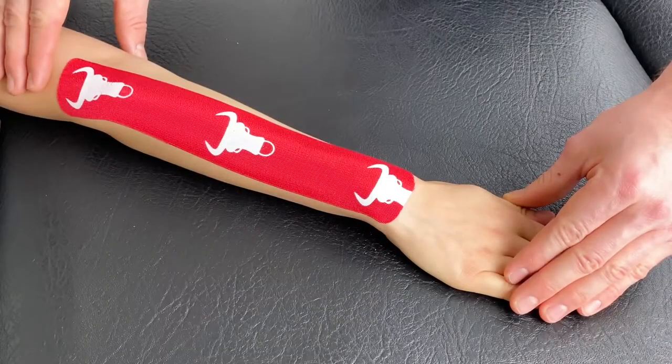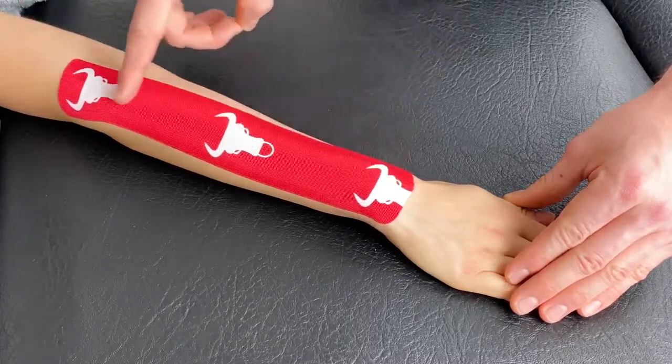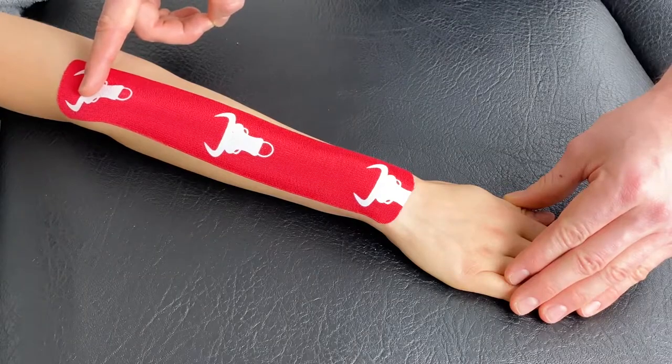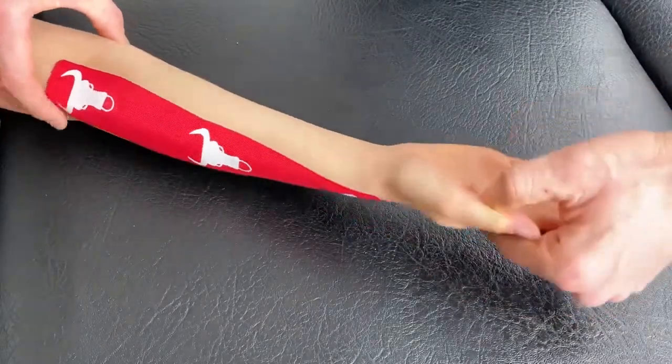This is a technique focusing on general wrist pain. The first piece will be applied from the wrist up toward the lateral condyle of the elbow with no stretch. We will then turn the patient's arm over.